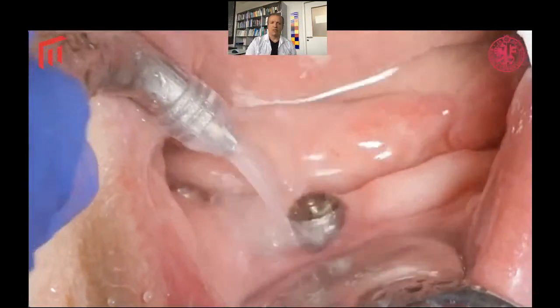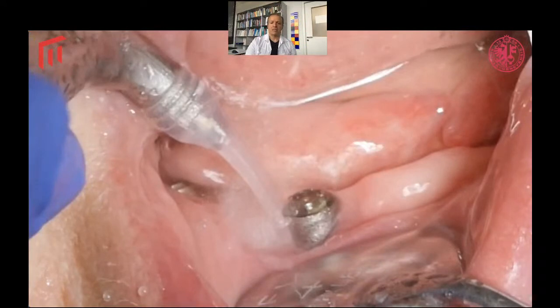So usually when I have such a case, I'm careful. I really try to see where the extent of the defect goes, and if it goes beyond the floor of the mouth, of course I'm extremely careful and I avoid using this device. In the other cases, I try to press with my finger the tissues tightly to have a mechanical barrier for the air.